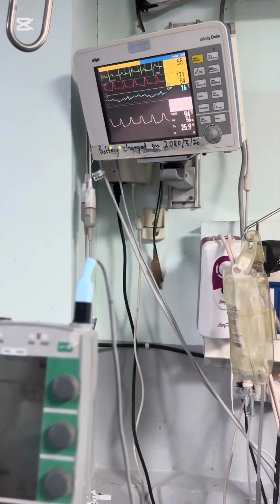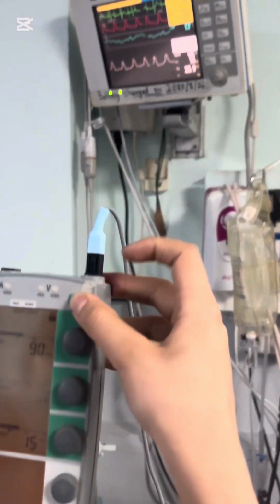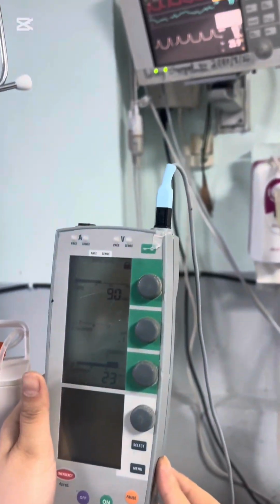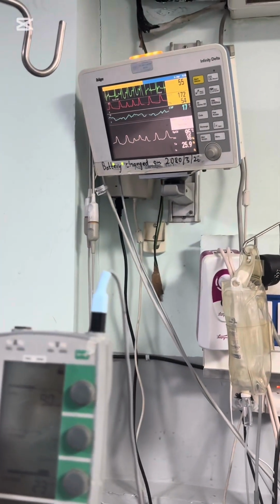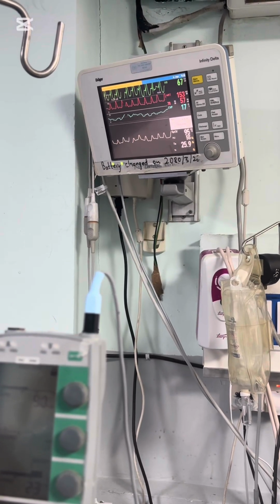Still pacing fails to capture. Then we increase the output to 23 milliampere. Now we see the pacing spike in the ECG. In this way, the temporary pacing box works during bradycardia by increasing the heart rate from 55 to the set rate of 90 beats per minute.